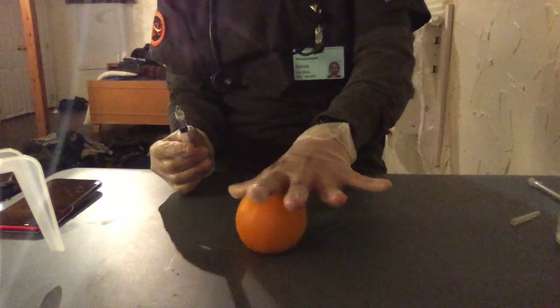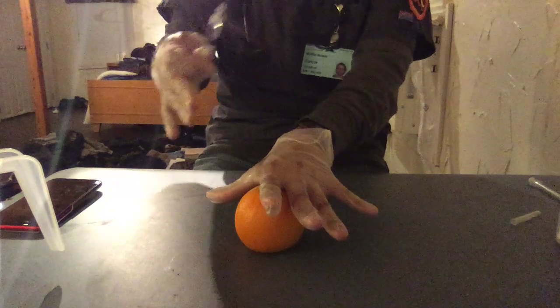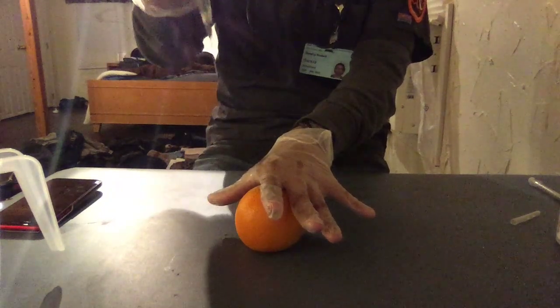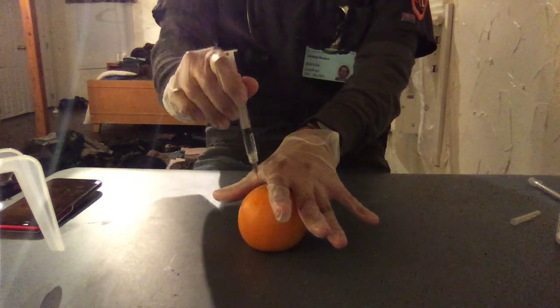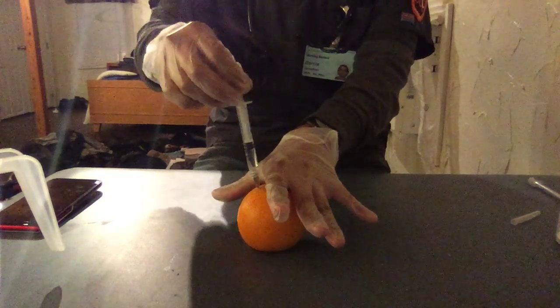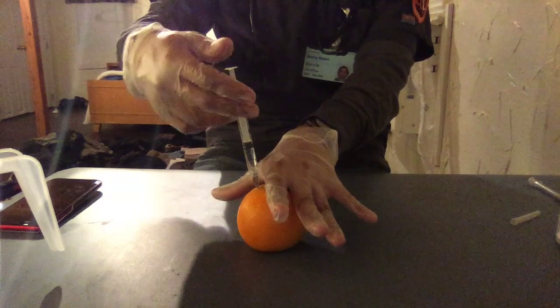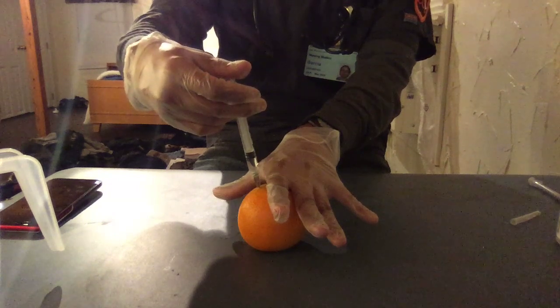So now, here is my crest, and here's my trochanter. Mrs. Smith is in the prone position. I will inject her at a 90-degree angle. I will aspirate before, just to make sure I didn't hit anything. There's no blood coming out. So now I will inject the medication.